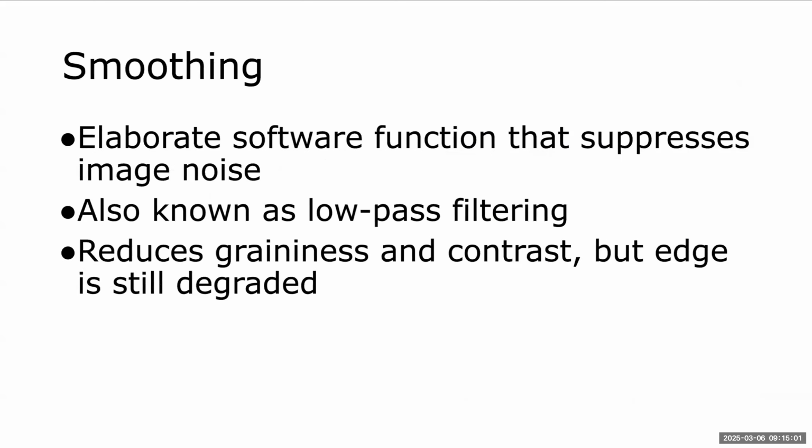Any post-processing that you do, you generally want to undo before you send it to the radiologist. It's fine to mess around with it if you're trying to see something, but generally you want to give them the original information so that it does not limit or narrow what they have the ability to do when they get it from PACS.